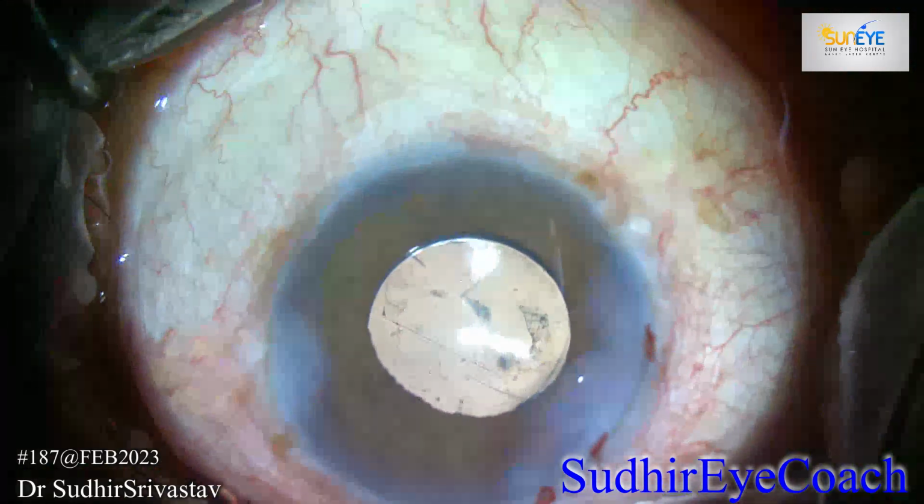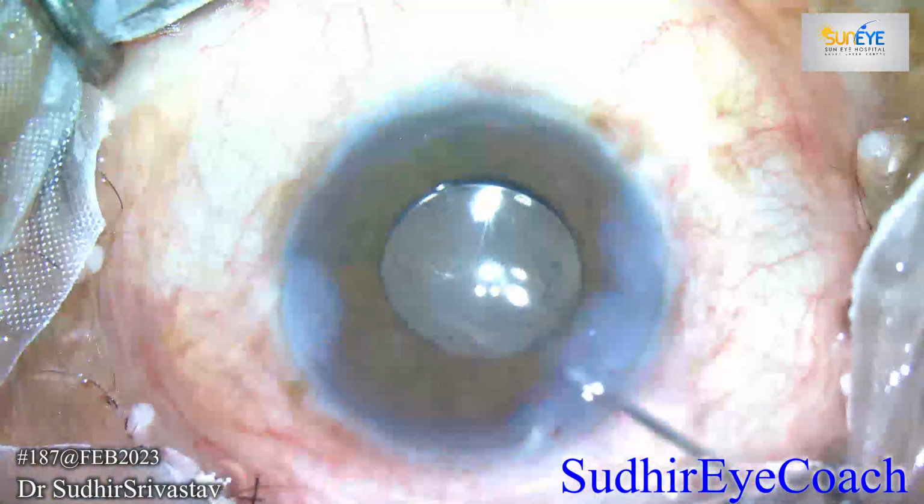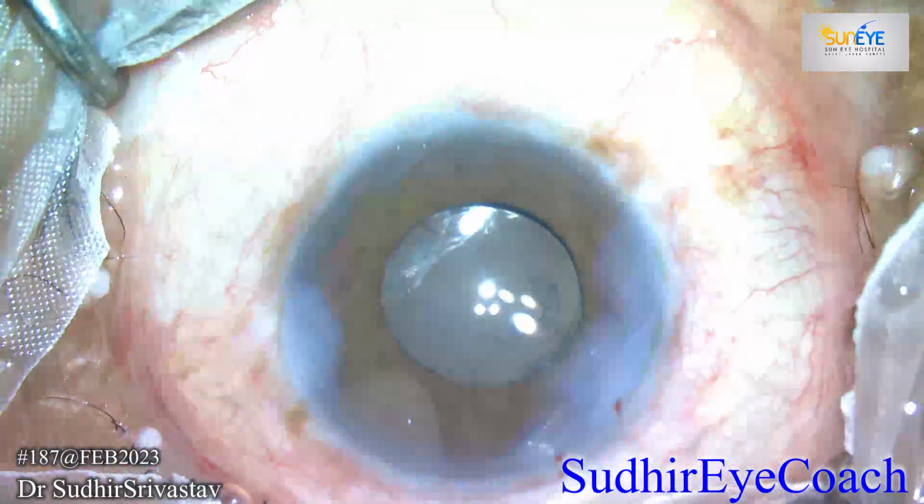Finally, I completed the surgery well, but I knew that this was not the decent way to handle the situation. It was always better to put a CTR, as you get the support, and in that way you can manage the case well.